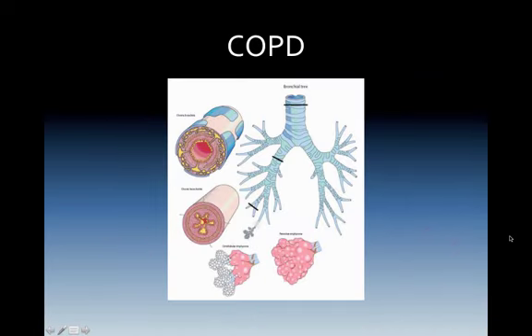In COPD, understanding of this is no matter if it's increased mucoid production or it is trapping of air from emphysema, we still can have bronchospasm events. From the perspective of the end-tidal CO2, the waveform will still look like a shark fin.